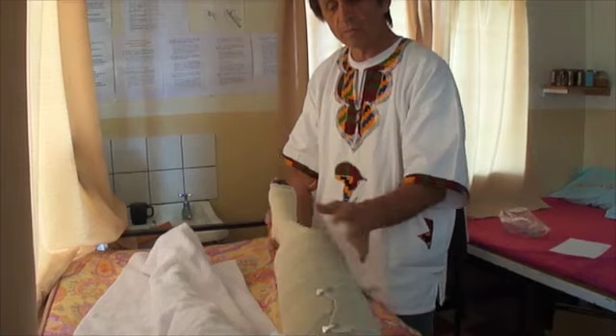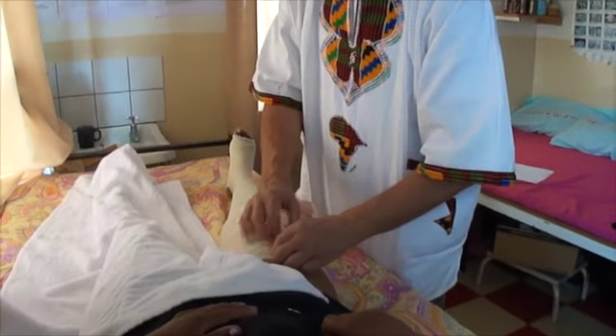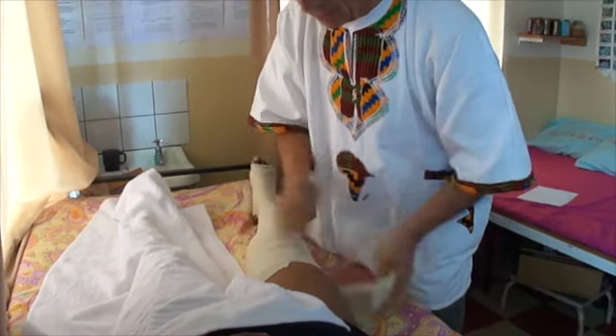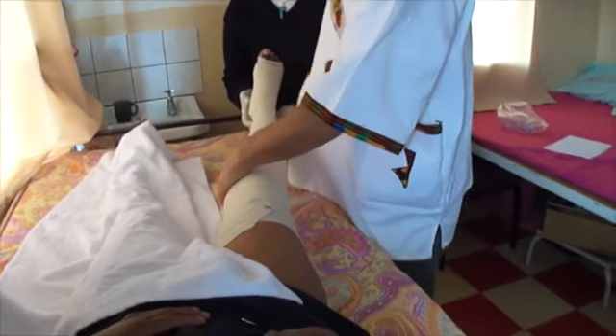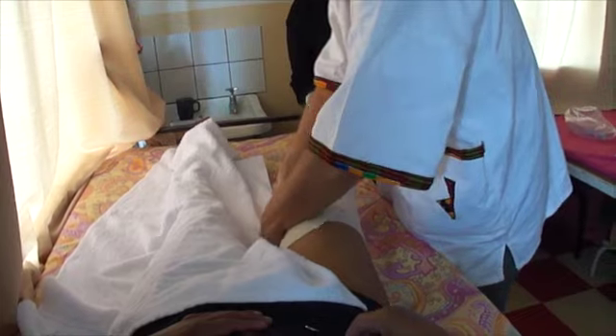The patient can walk with this bandage and they can elevate the leg on pillows with this bandage. They can even do a little bit of movement, but not too much otherwise it comes off. When we take off the bandage, we do an assessment. Look at the edema when you take off the bandages — it will show you if the bandage was perfect, quite good, okay, or somehow irregular.